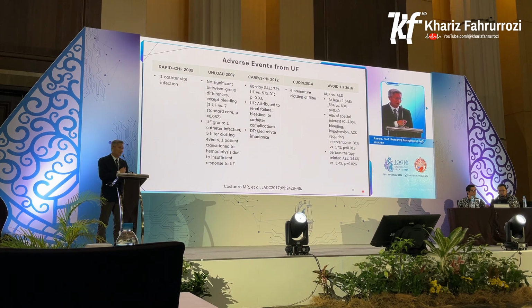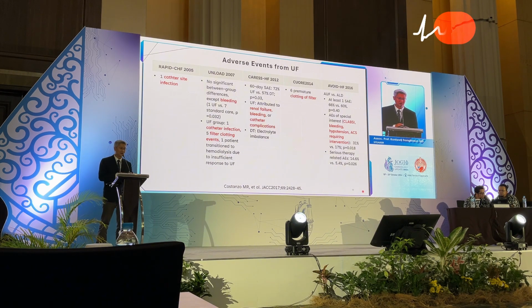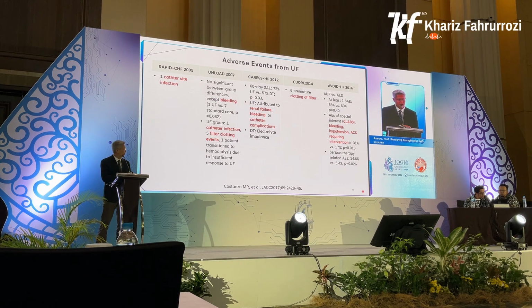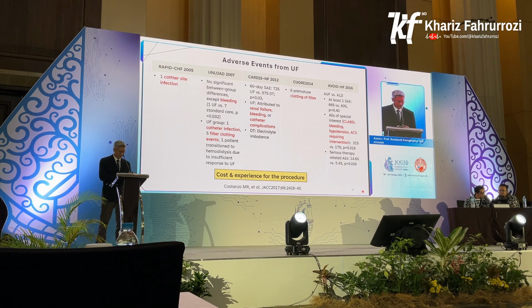I would like to show you what the adverse effects of ultrafiltration are. Sorry that there are many details in this slide, but I will highlight that most of the adverse effects seem to be similar to CRRT or even intermittent hemodialysis. For example, bleeding, catheter infection, or clotting, which are quite common for extracorporeal therapy, right? And sometimes we encounter a lack of experience with these procedures.